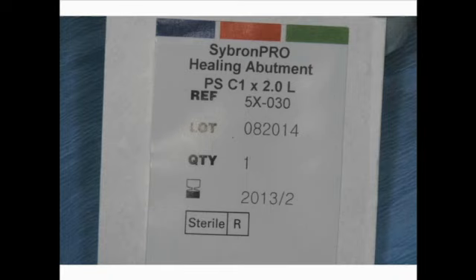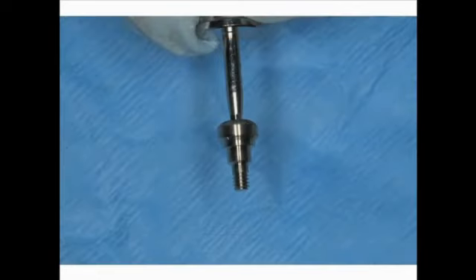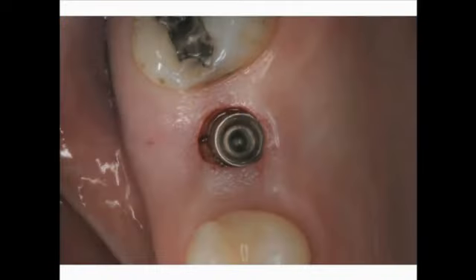And here we see the internal packaging. It's a platform switched 2 millimeter long healing abutment, which will allow a nice position. Here is the healing abutment in a hex driver, a hand hex driver that will be used to place this healing abutment into our implant.